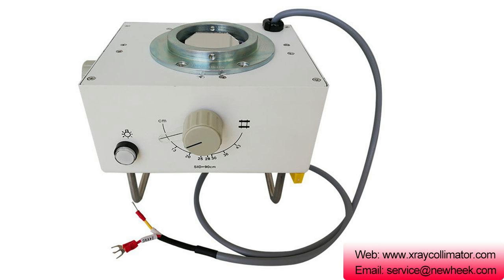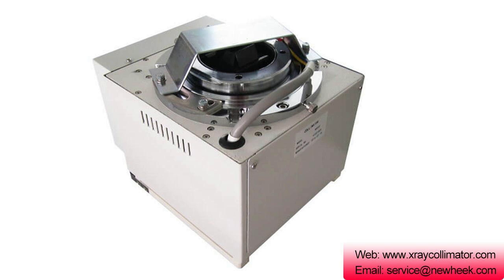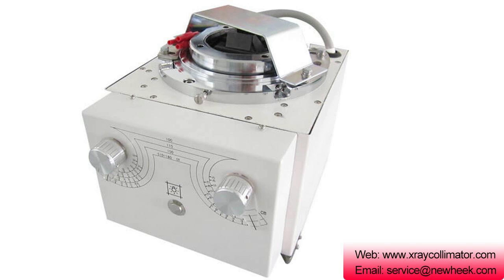The electric X-ray collimator is mainly used in fluoroscopy, which is convenient for long-distance control and can better observe the focus of rays. For remote control of a gastrointestinal bed, it is an indispensable component.